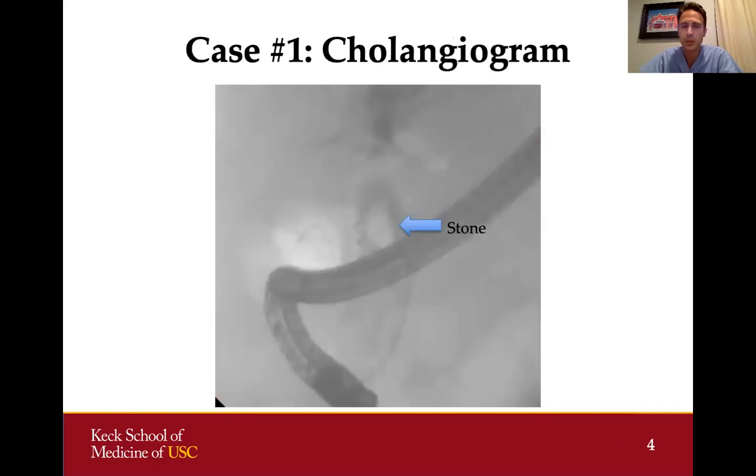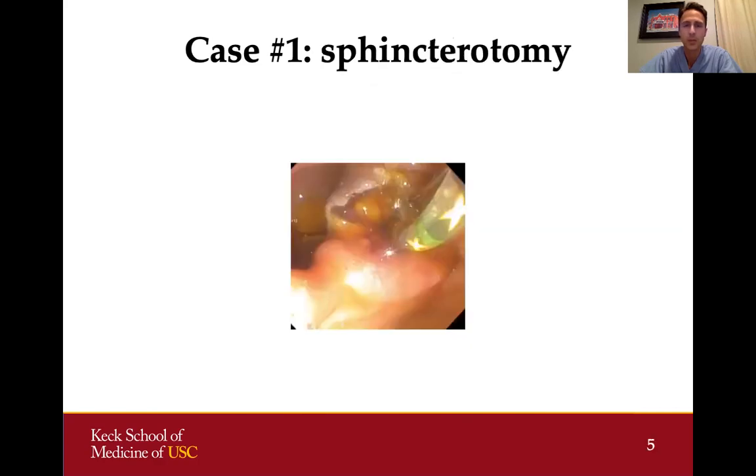Once we perform a cholangiogram, you can see a large filling defect in the bile duct measuring almost two centimeters in size. A stone of that size can be quite challenging to remove. The first thing I did was increase the size of the sphincterotomy. You can see now we have a much bigger bile duct opening, which will not only help remove that stone but also help get into the bile duct more easily in the future.